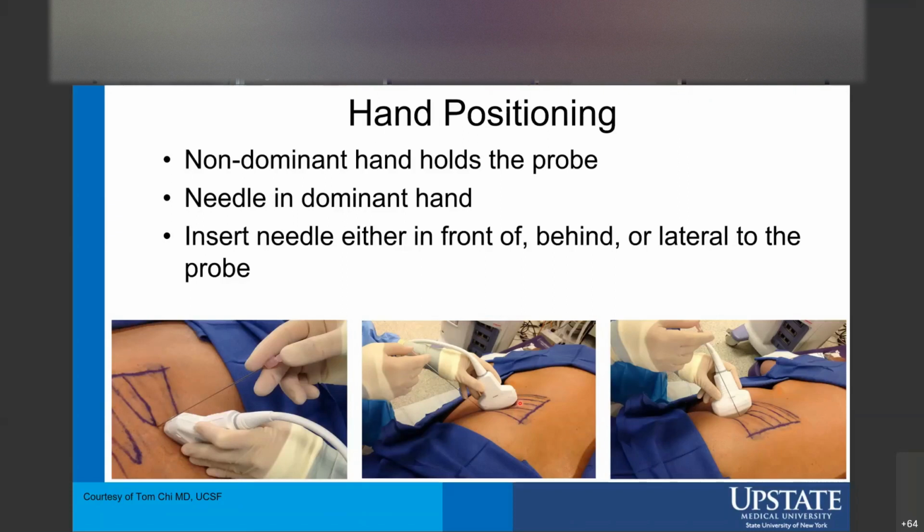There's a couple main techniques demonstrated here, which we will go into in depth further. There's the transverse needle placement, and there's the longitudinal needle placement. So longitudinal has the needle in the front of the probe here, and transverse has it on the side of the probe.